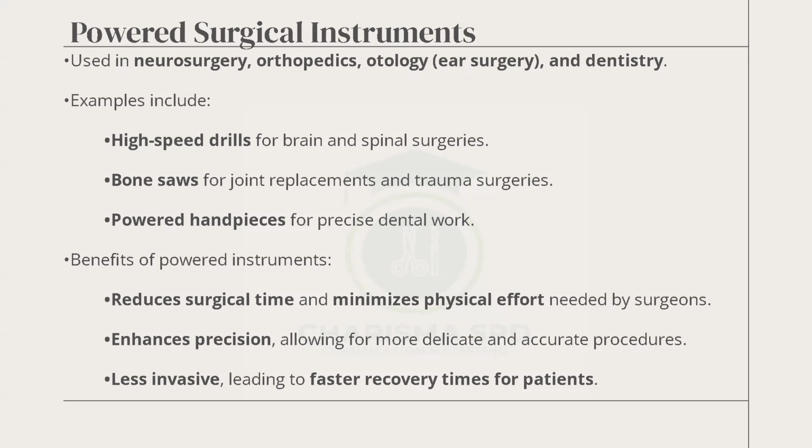And then they saw the bone, they cut it. Maybe if you're doing an amputation, you have diabetes and your leg is getting bad, they amputate, they use the bone saws to do that. Powered handpieces are used for precise dental work. So when you come to CSPD and you are dealing with powered instruments, you see a variety of them from different vendors: Stryker, Wright Medical, Synthes, Linvatec, and a host of others. You will be given training, so don't be scared, but they need special attention and they are very expensive, so they don't have to be treated lightly.